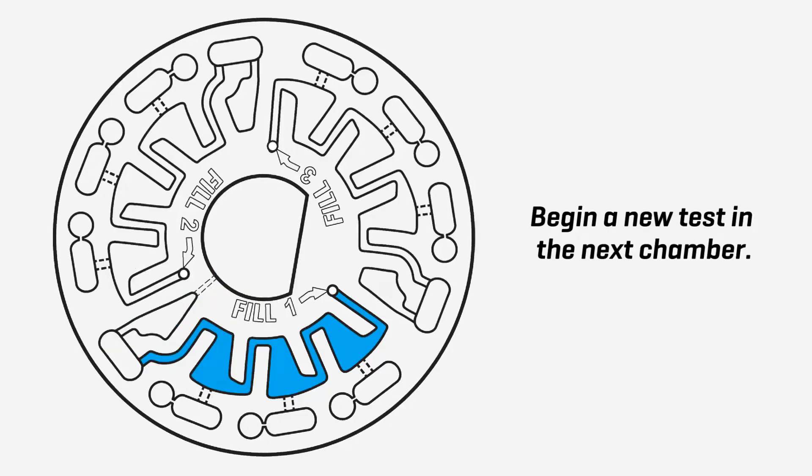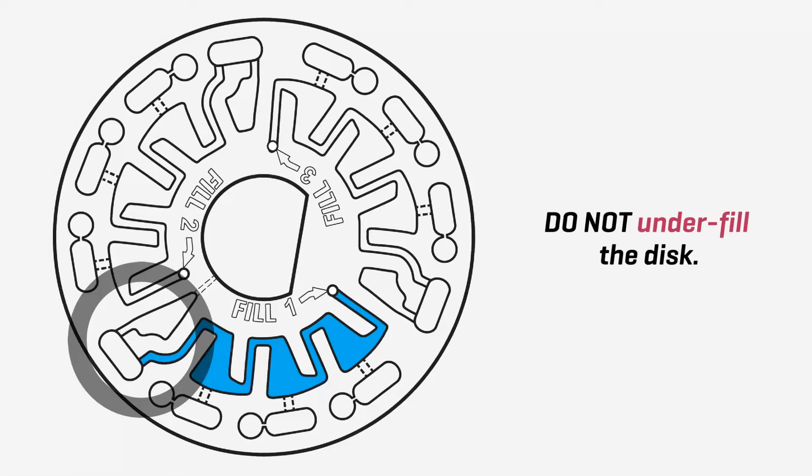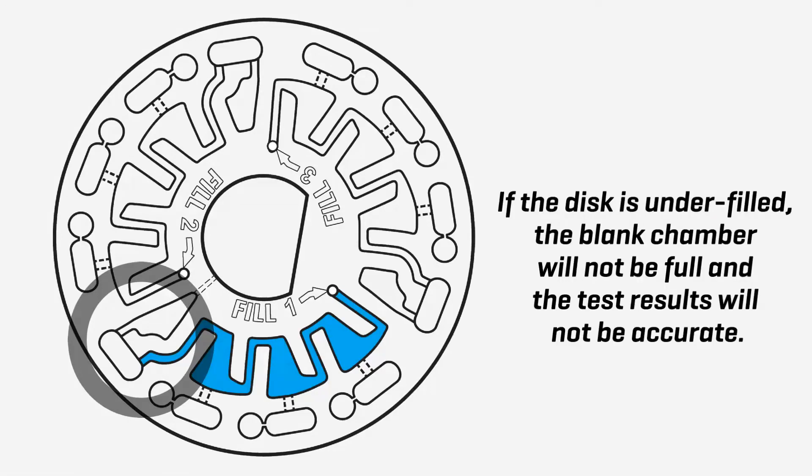Begin a new test in the next chamber. Do not underfill the disc. If the disc is underfilled, the blank chamber will not be full and the test results will not be accurate.